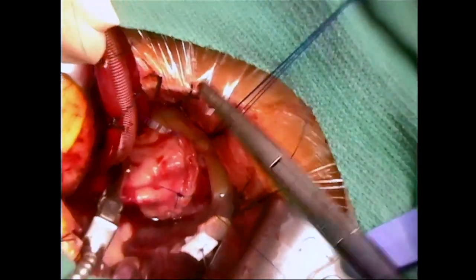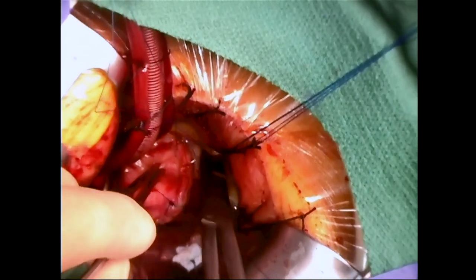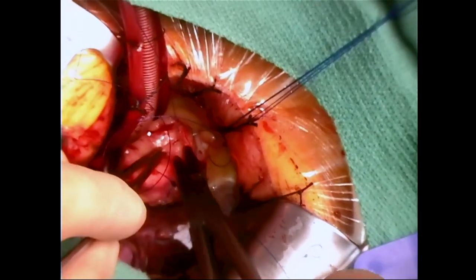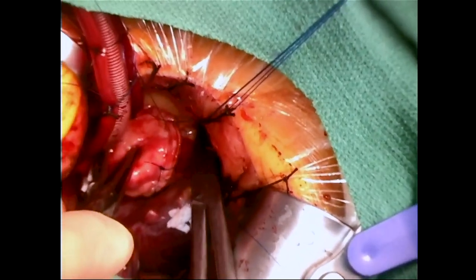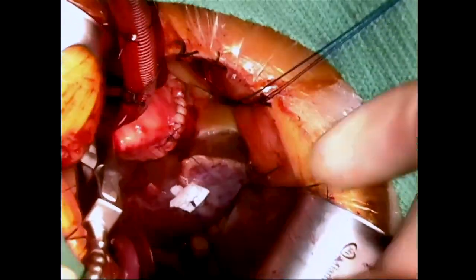Closure of the aortotomy is performed with two sutures, pledgeted at each end. We perform a two-layer closure with four-zero prolene, the first layer being a horizontal mattress followed by an over-and-over layer.